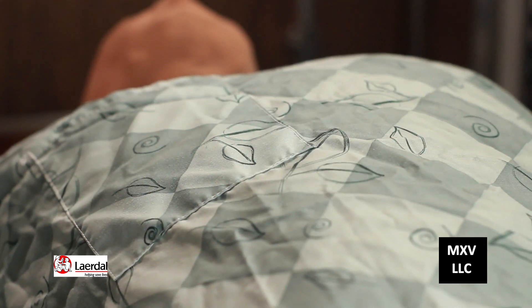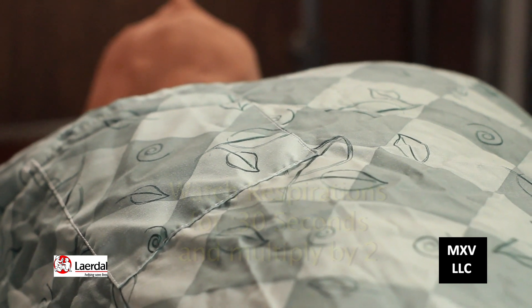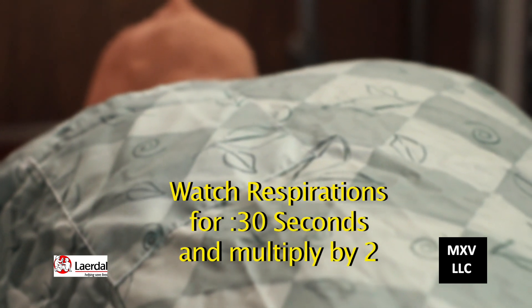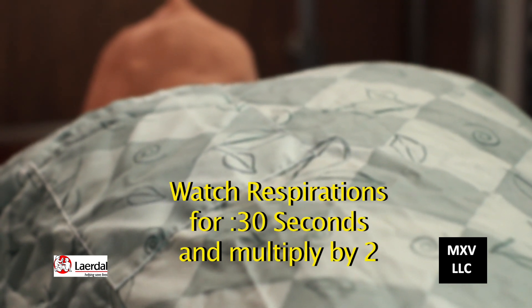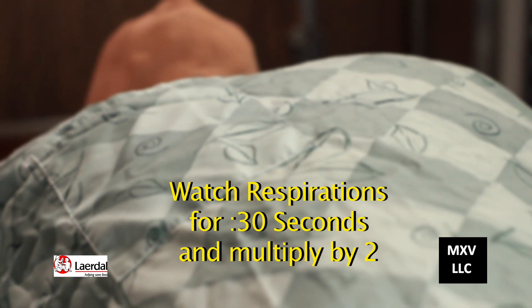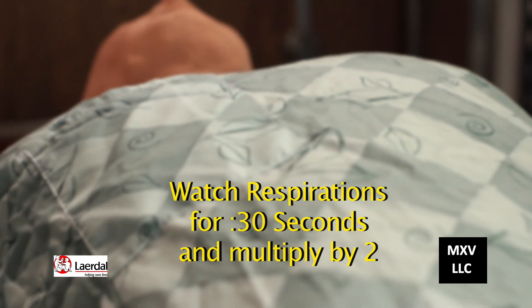If the stethoscope is not available, or if you find yourself in an emergency situation, you can also assess the respiratory rate by watching the chest rise and fall. Count for 30 seconds, multiply that by 2, and you can also get the respiratory rate that way. Go ahead and make that notation on your clipboard.